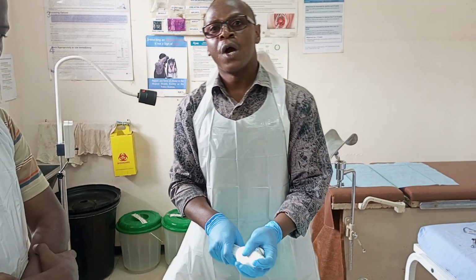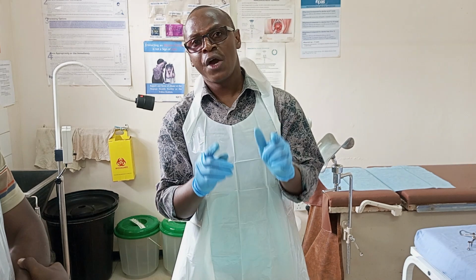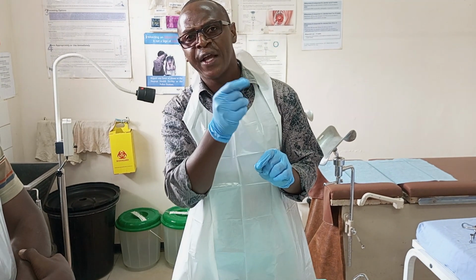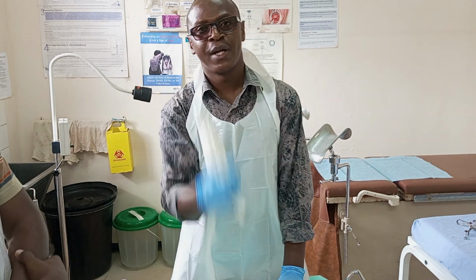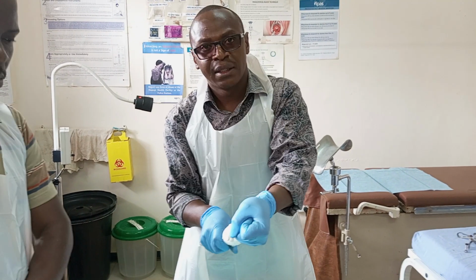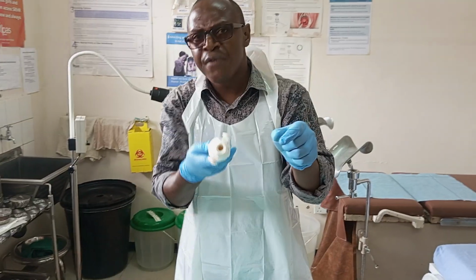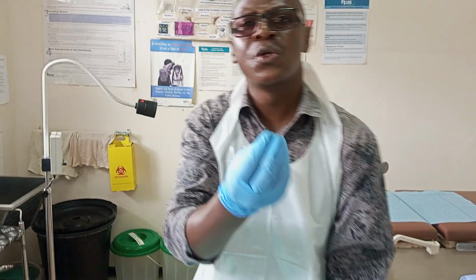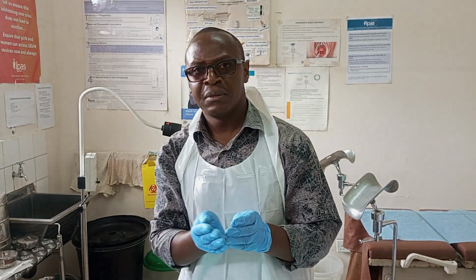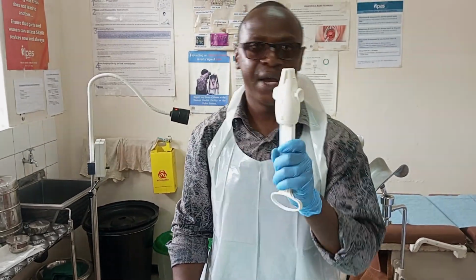Another one, when you are collecting an endometrial biopsy. Endometrial biopsy, any tissue that you would want to extract, to collect from the lining of the uterus, you can actually use the gadget. Because with it, you are going to connect a cannula. Remember those cannulas have got some holes in front. So as you are evacuating, cleaning the uterus, in the process, you end up collecting part of the tissue from the uterus lining. So it's used for collection of endometrial biopsy.